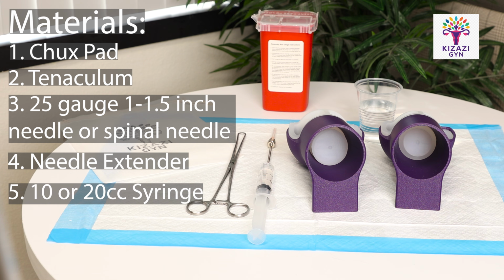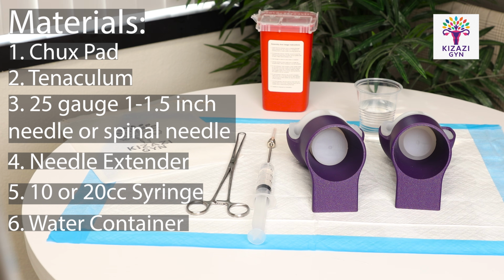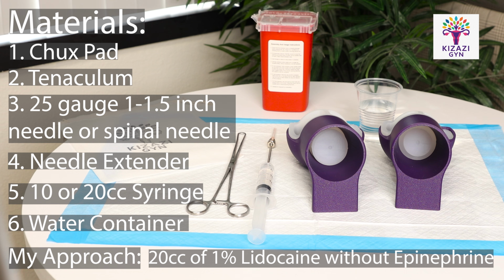Number 5, a 10 or a 20 cc syringe. And number 6, a cup for water to simulate the lidocaine. My approach is to use 20 cc's of 1% lidocaine without epinephrine as my anesthesia of choice.